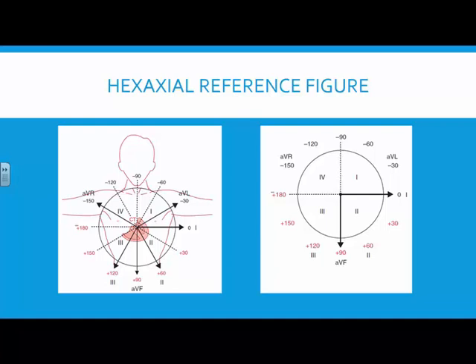So we've got that's positive and that's negative. Now my axes aren't perfect here, but y'all get where I'm going with that. So now I'm going from my negatives here and my positives here. I'll give you a hint. It's an augmented lead.